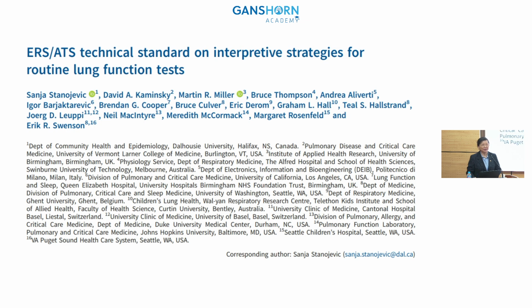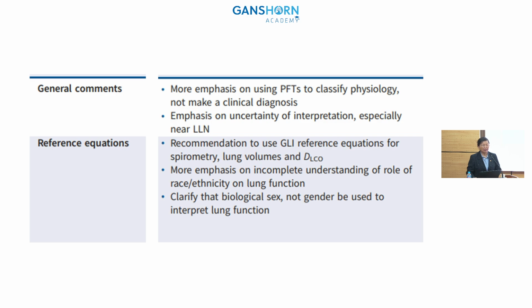I would like to remind you about this very important article, the ERS ATS technical standards on interpretive strategies for routine lung function tests. Here are some key points.